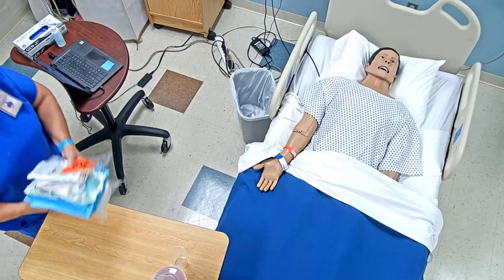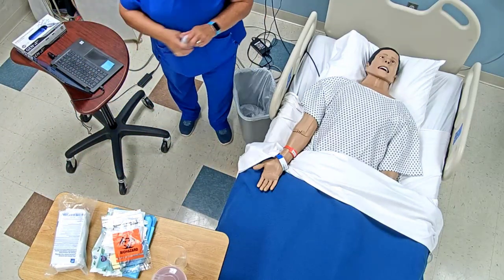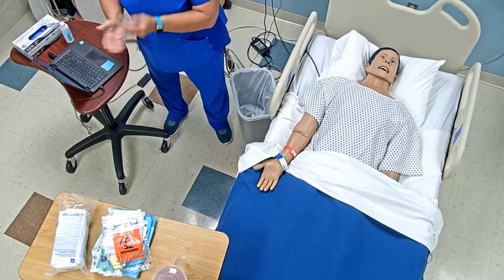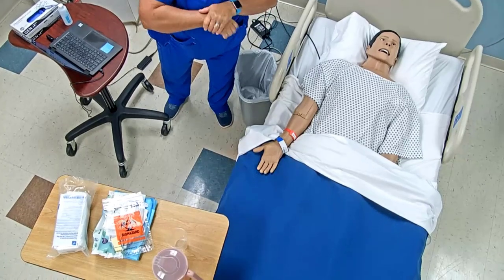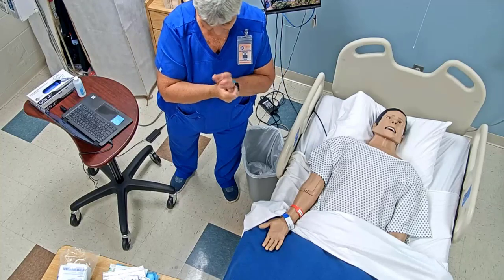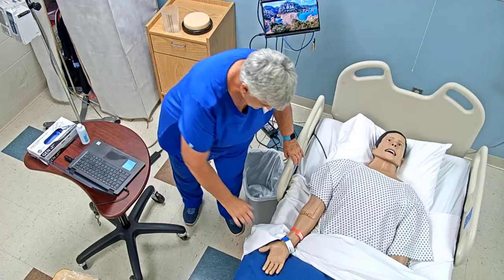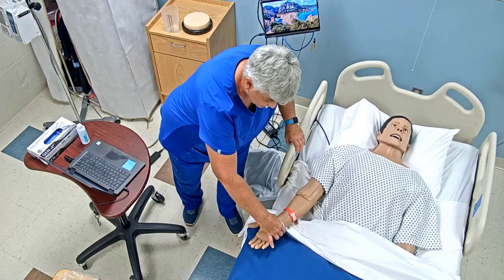Knock, knock, knock. I'm going to set my stuff down on a tray. Good morning, my name is Jan Buckskemper. Of course, you would wash your hands as you're coming into the room. So good morning, my name is Jan Buckskemper. I'm a registered nurse. You would identify yourself as a student nurse from South Plains College ADN program. Let me pull up my computer real quick. Okay, can you tell me your name and date of birth? Brad Taylor, date of birth 4/24.